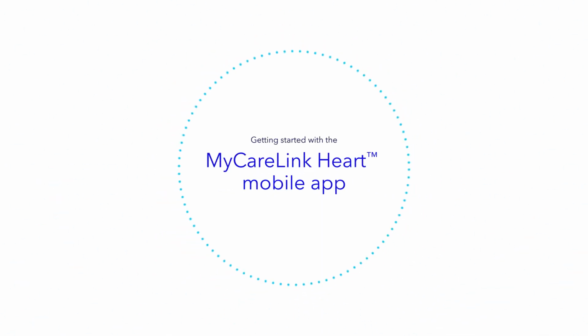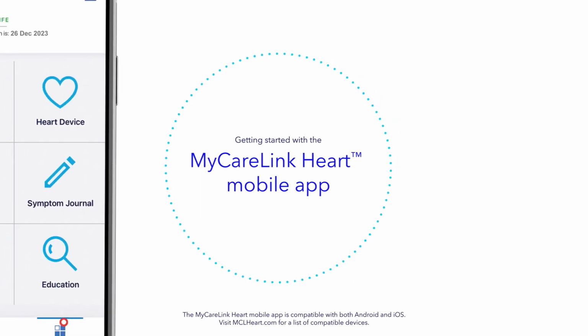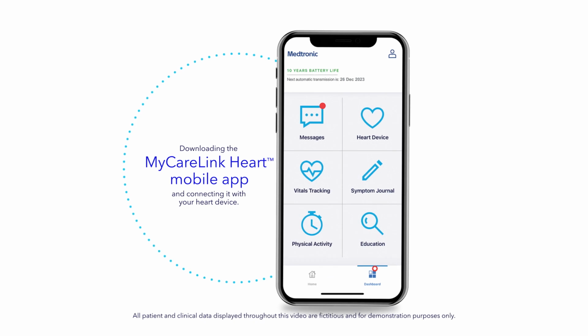Your doctor has prescribed the MyCareLink Heart mobile app to remotely monitor your heart device. This video walks you through the MyCareLink Heart download and setup process, step by step.